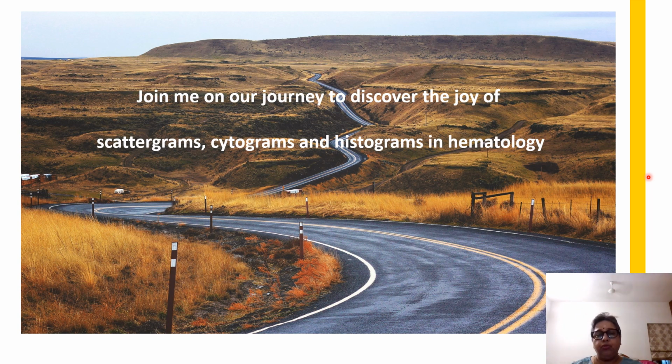I want you to join me on this journey where we discover the joy of scattergrams, cytograms, and histograms and use them in interpretation of the hematology samples that are processed in our labs, the interpretation of our complete blood counts. We shall look at individual examples, we shall look at cases in subsequent videos.